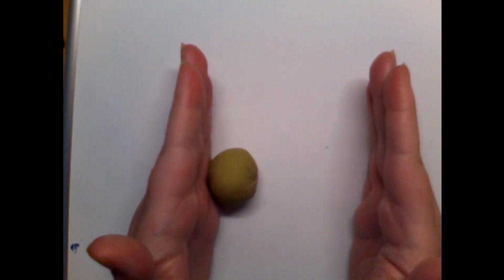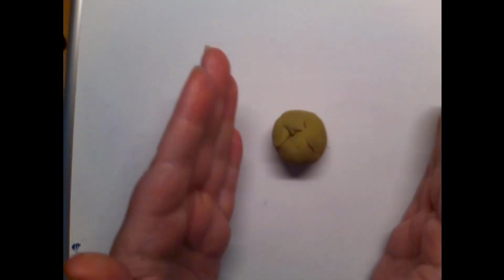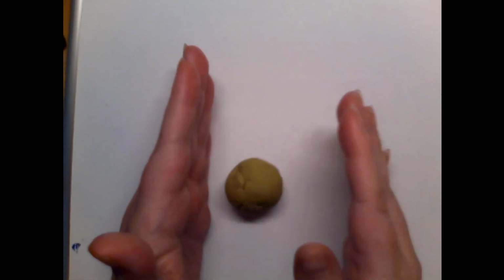Let's see, I'm going to pull out some Play-Doh here. I think that'll help to describe this. So I'm just going to make a little Play-Doh ball. And we're going to say that my Play-Doh ball is the pulse. So if I have my hands, one hand represents the transducer, my other hand represents the maximum depth that that pulse has to go down to and then return back. Okay, so I'm going like this, back and forth, back and forth. This is pretty quick, right? Those pulses can bounce in between very quickly. There's not a lot of space in there. There's not a lot of off time. This hand is not waiting very long to receive the pulse back.